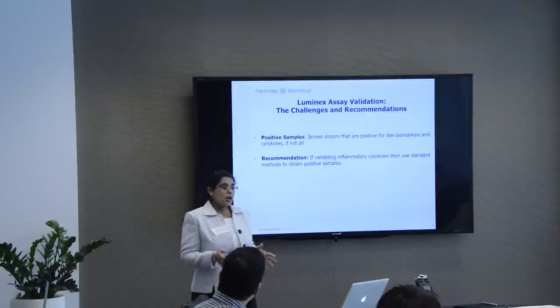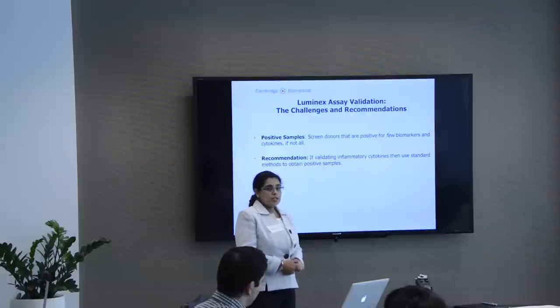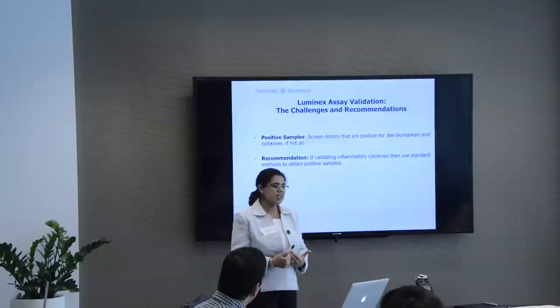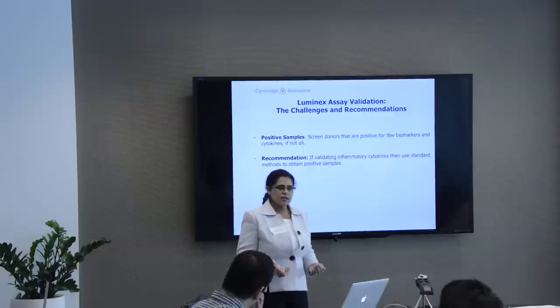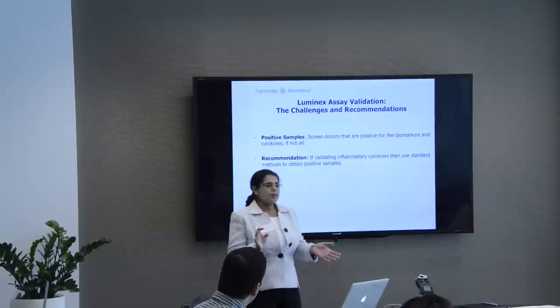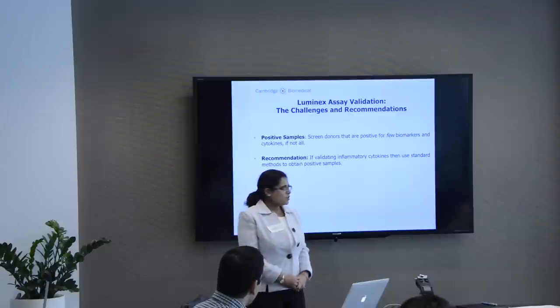So my talk is going to be focused on Luminex assay validation. I'm going to talk about some of the challenges that we face during Luminex assay validation, and also provide some recommendations. Not FDA recommendations, but our recommendations that we have observed while running this test again and again in several different studies. So the most important thing is positive samples. Think about it. You have 15 different cytokines to test. You need those couple of samples that are positive for all those 15 cytokines.